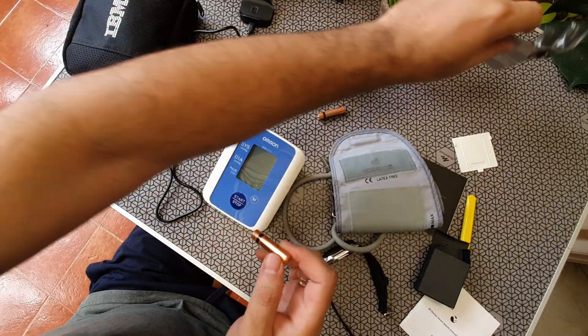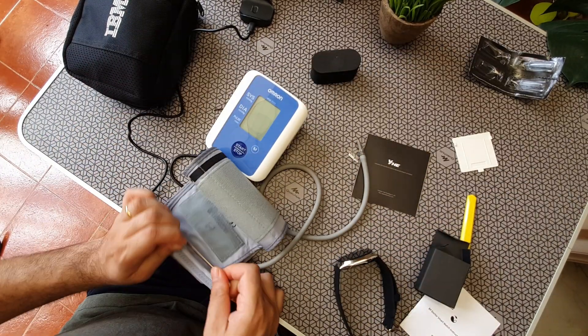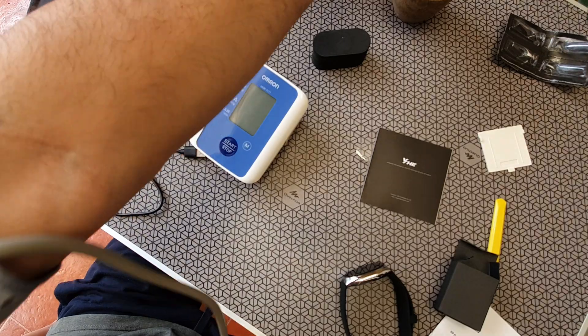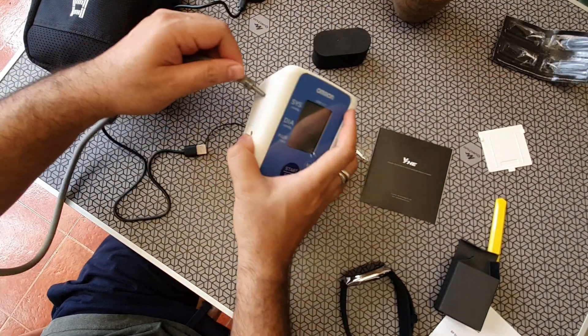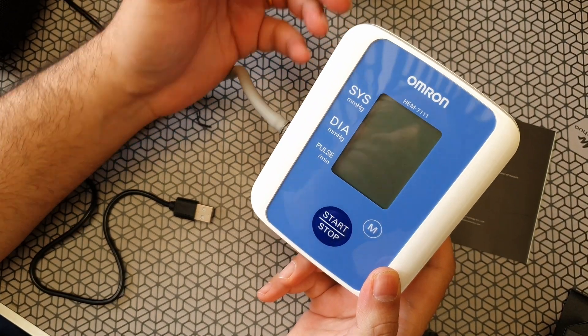Here's a real-world test. I borrowed a BP monitor just to see how well the watch compares. Just imagine the kind of hassle this watch helps you avoid — if you want to put a traditional BP cuff on, it takes at least five minutes and you sometimes need help, plus batteries. This is where the watch actually shines.